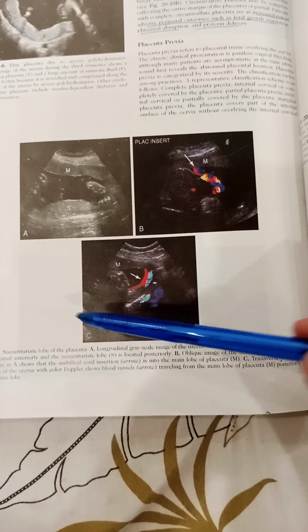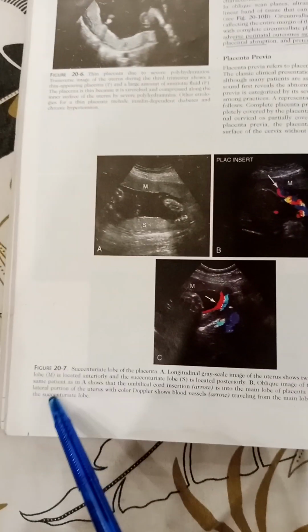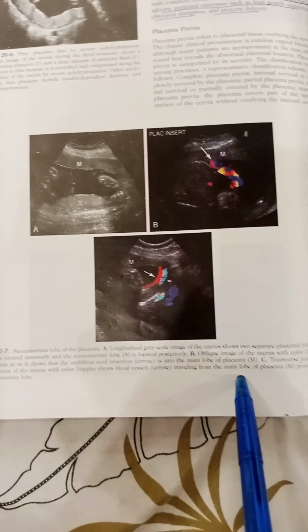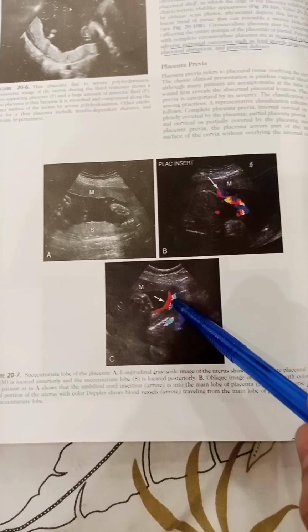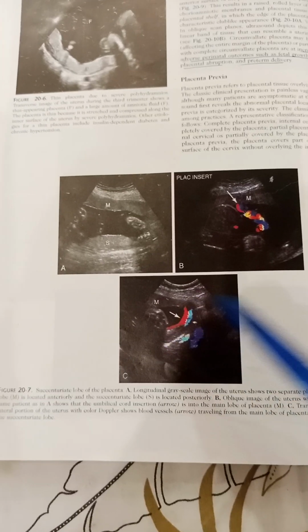And in C, the transverse image of the left lateral portion of the uterus with color Doppler shows blood vessels traveling from the main lobe of the placenta posteriorly towards the succenturiate lobe. The vessels, they are going from the main lobe towards the succenturiate lobe.